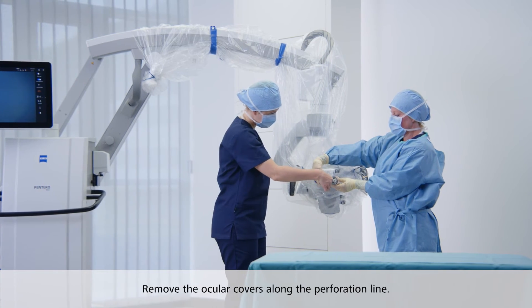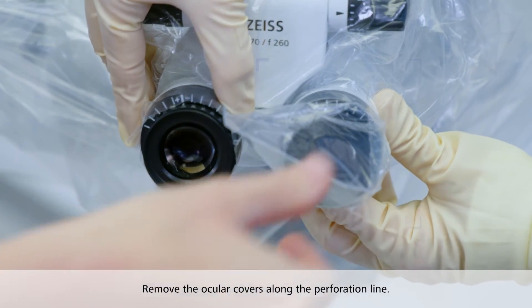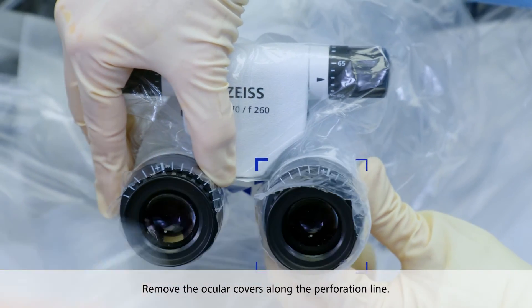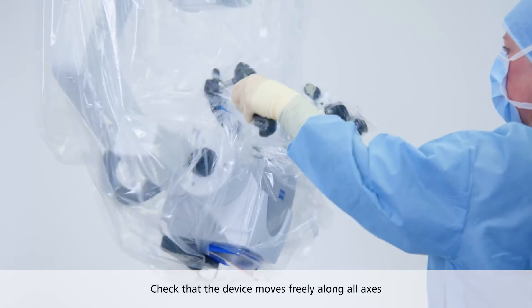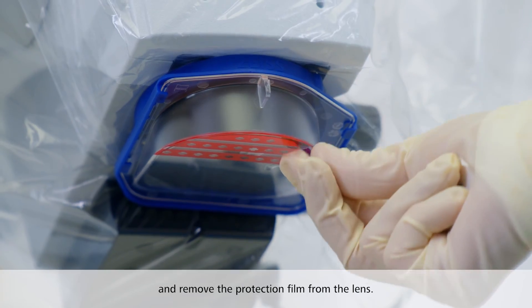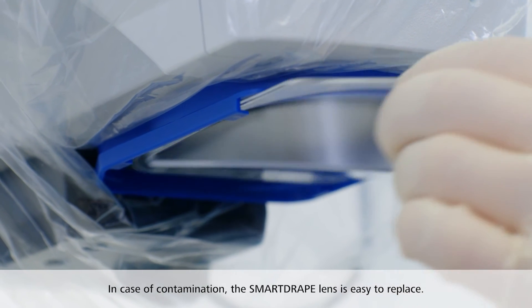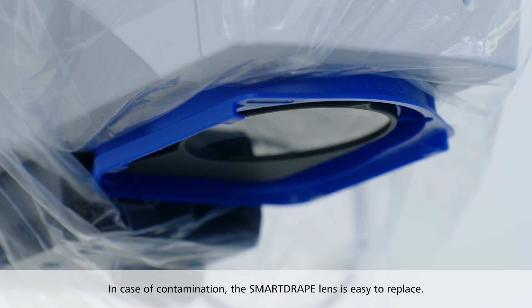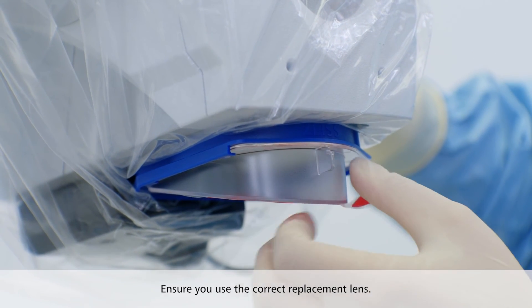When working with oculars, remove the ocular covers along the perforation line. After draping, check that the device moves freely along all axes and remove the protection film from the lens. In case of contamination, the SmartDrape lens is easy to replace. Ensure you use the correct replacement lens.